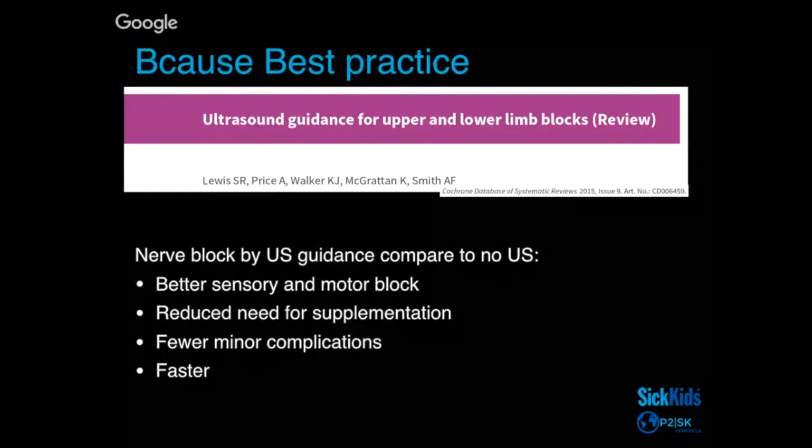So especially in anesthesia, a lot of people would be doing that without ultrasound, and even in the emergency. And I guess just because of the legal point of view, in the States, they started using the ultrasound more and more. But there are a lot of places in Europe, at least, where no one would use the ultrasound. Yeah, and even here in the OR, they don't use as much the ultrasound.